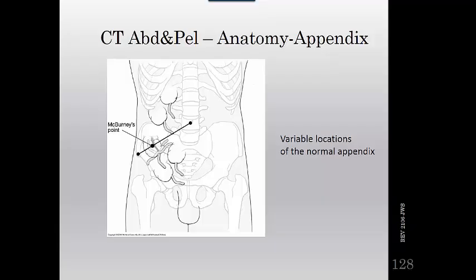You're going to eventually be asked to scan someone for appendicitis with a non-contrast by some ER physician or a mid-level provider just because they don't want to wait on scan time or for the prep time. So now you've got a reason to tell them, look, this patient is thin, then I really need to give them oral and IV contrast because you could misdiagnose this, or radiologists can misdiagnose this on thinner patients.